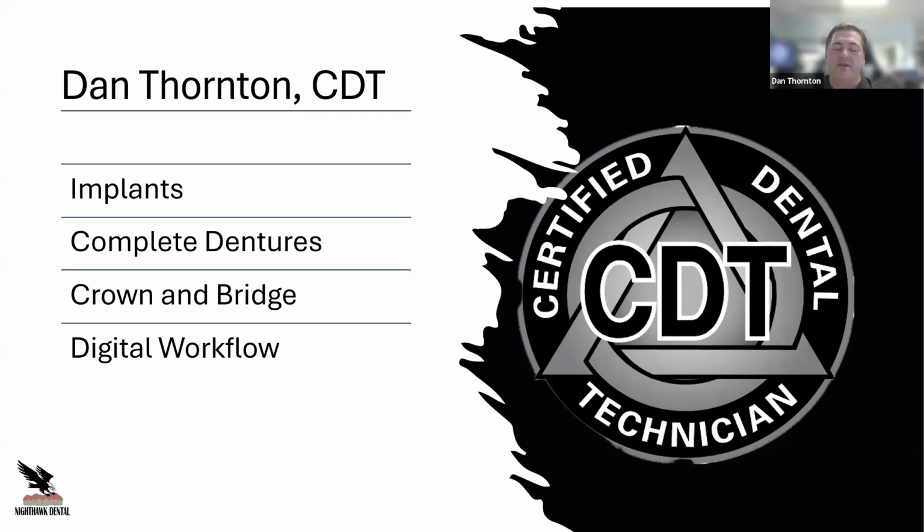Nice. Digital is coming along so much that a lot of the conversions I do are with a printed denture. The reason is because I can carry a backup. I can print two for the day of surgery, and if anything happens to the first one, I have a backup waiting to go.